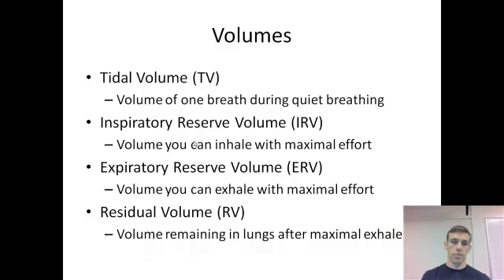Conversely, the expiratory reserve volume is the volume you can exhale with maximal effort. So I'm breathing normally, and if I breathe out as much as I can, you can feel your abs get tight and you're trying to push out as much air as possible. That's an exhale with maximal effort. That's the ERV. And then the residual volume is the volume remaining in the lungs after a maximum exhale. Even though I try to exhale as much air as possible, there's still going to be some air left in there. That's the residual volume.